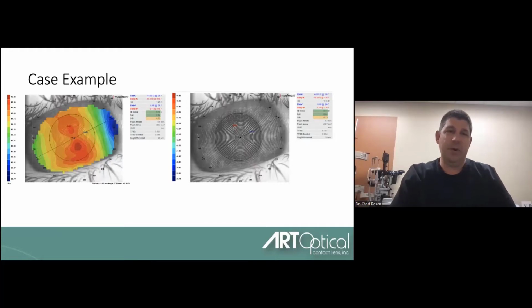Now, based on what I've shown you already, we kind of already start to see some of the artifacts. We've got our lids too squinty. We've got some weirdness going on in this bottom portion. Is this an irregular cornea or is there something going on? When I take the color off, you can see there's some ring jam going on down there. There's a little bit of excess tear possibly there, causing all kinds of artifacts.